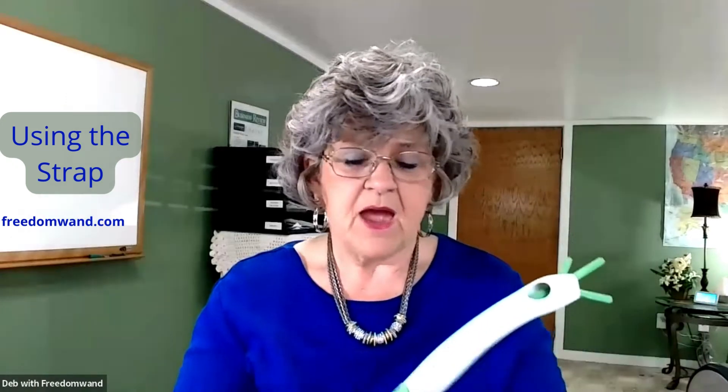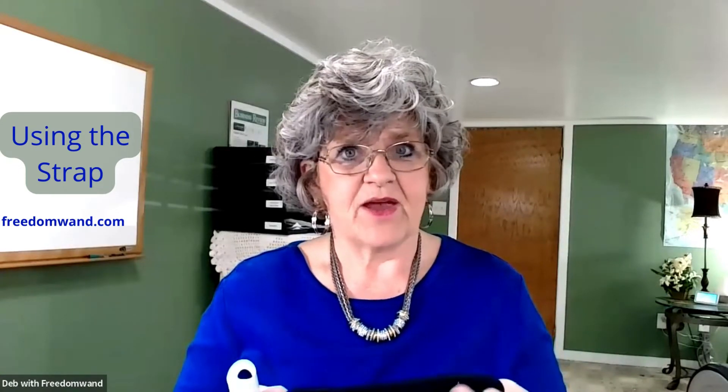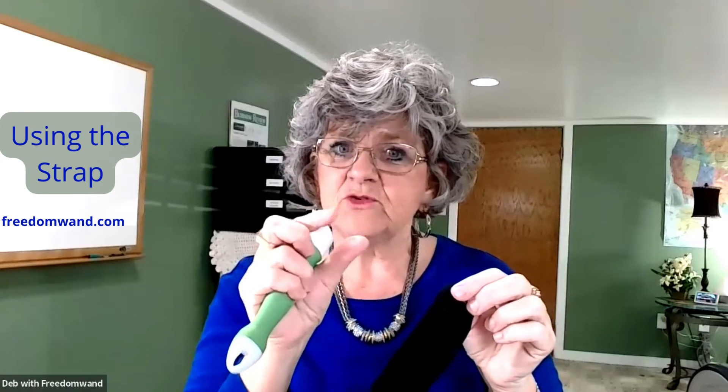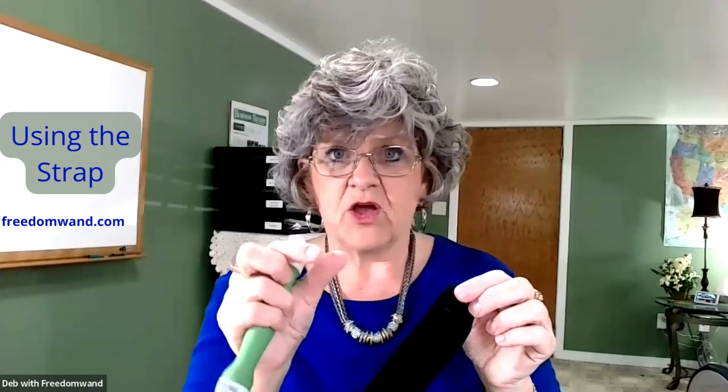I want to show you the strap. We created the strap because our little people asked for it. Their little fingers are nice and short, and the strength in our fingers is due to the muscles. So if you have very small fingers, you're going to have not as long of muscles.